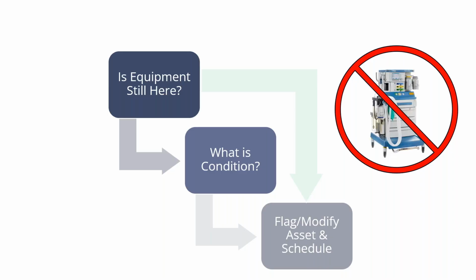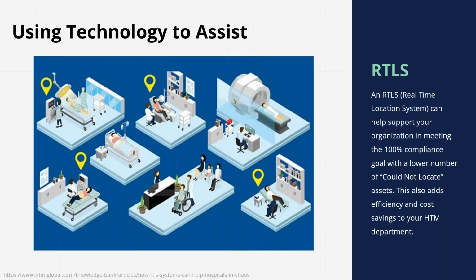And then if you need to change anything about that asset, like the condition field, the status, change the schedule, you need to PM it more often. Maybe the schedule was wrong. So are you verifying all those things around it? As new equipment comes in, maybe somebody did schedule it incorrectly. So making sure you understand what it should look like and make modifications to that, again, every time. And we recommend this on anyone doing maintenance in any part of the area. Equipment gets beat up, and that's something that's usually not part of the regular OEM manufactured tests as part of that PM.